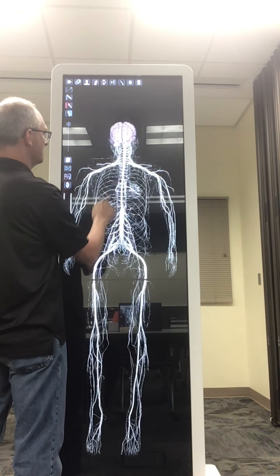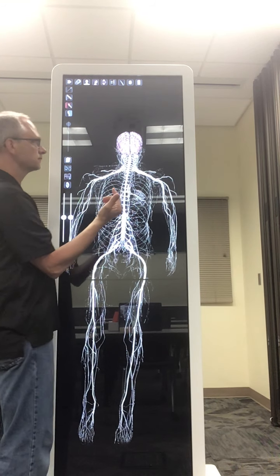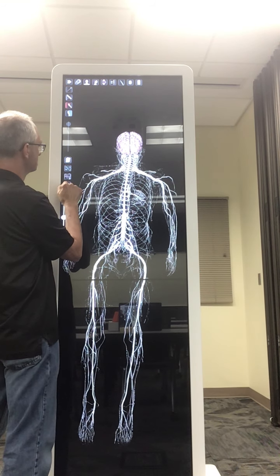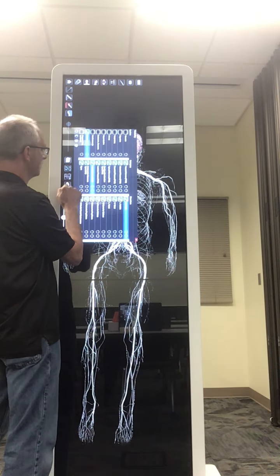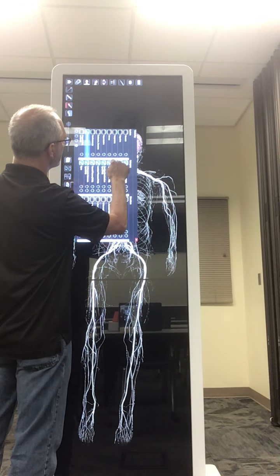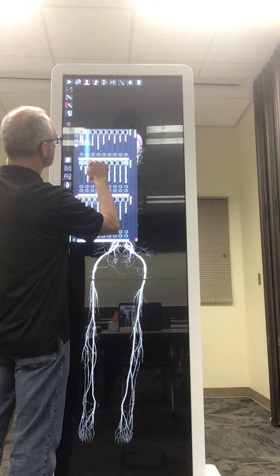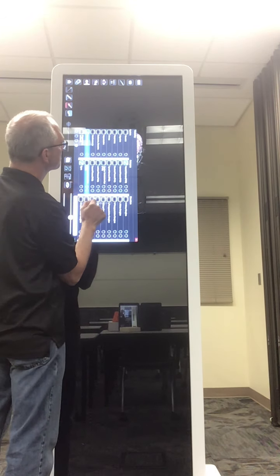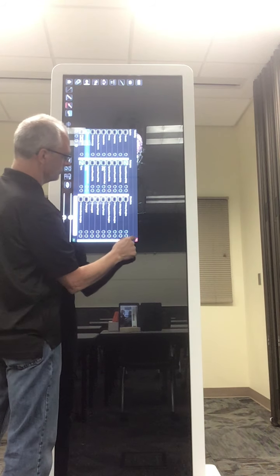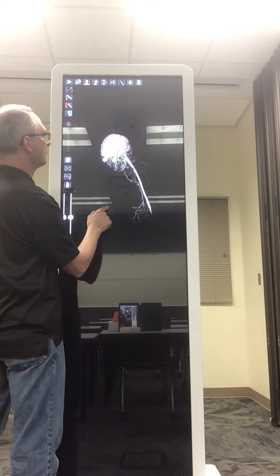I'm going to take you up here. Do you want to just take a look at the brain? Yeah, we can take a look at the brain and cranial nerves. That's fine. Okay. Leave the cranial nerves, get rid of these and this spinal nerve. And then probably after this, we can just take a look at the brachial plexus, since doctors love learning about the brachial plexus.